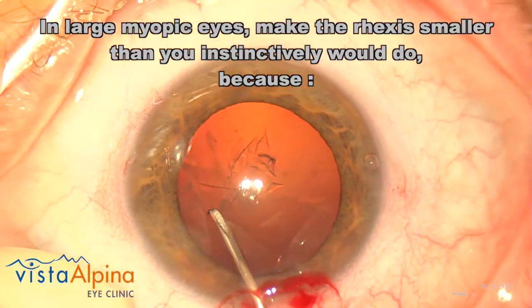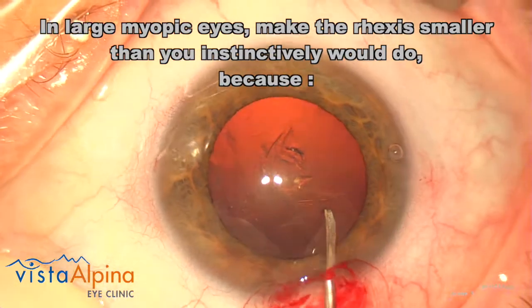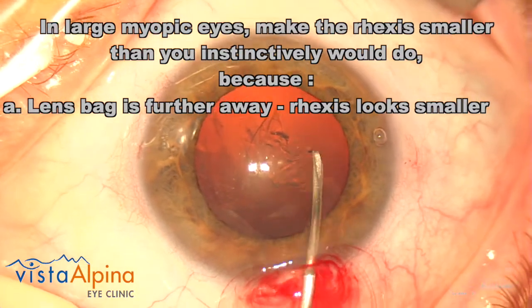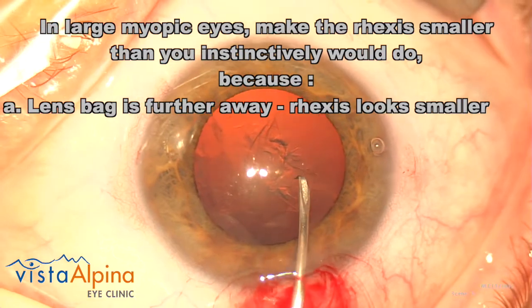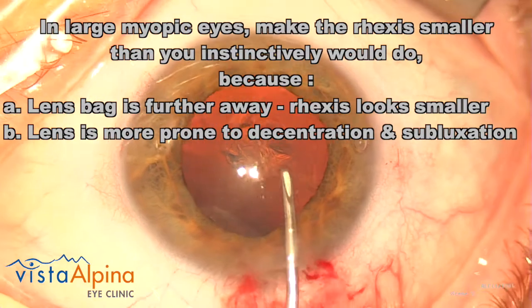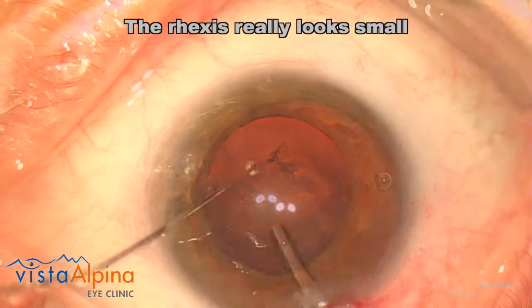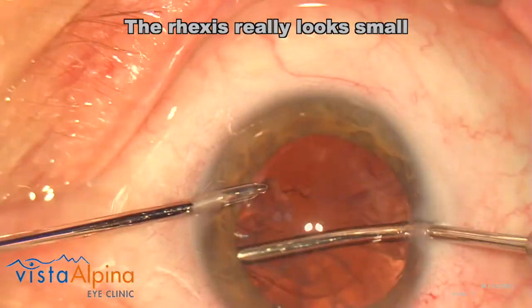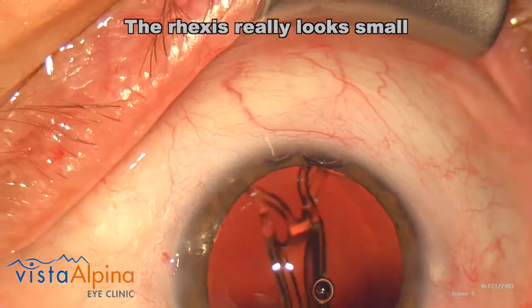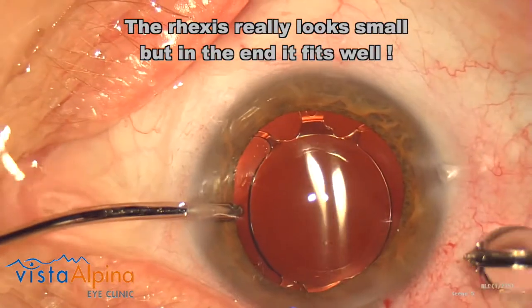On a side note, I take the opportunity to highlight the challenge of capsular rhexis sizing in large myopic eyes. First of all, the rhexis will always look smaller because we cannot rely on the pupil size of these oversized eyes. And second, the lens has a lot of space to move around in these large eyes and potentially to subluxate. You therefore want the rhexis to really overlap the optic a full 360 degrees, stabilizing the lens in the long run. So in large myopic eyes, always aim for smaller and you will do well.